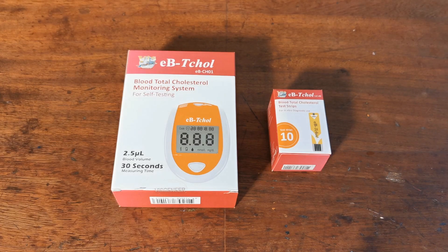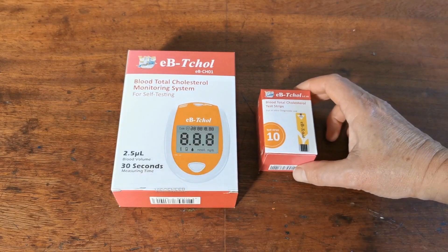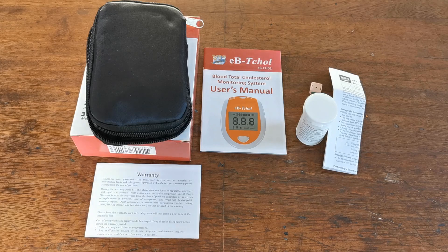Welcome to this Valumet presentation of the EBT-CHOL Total Blood Cholesterol Monitoring System for Self-Testing. This is a digital meter system. This is the starter pack on the left, and we sell this with 10 total blood cholesterol test strips so that new purchasers can get testing out of the box. Let's open it up and show you the contents and what you get when you buy this cholesterol test kit.